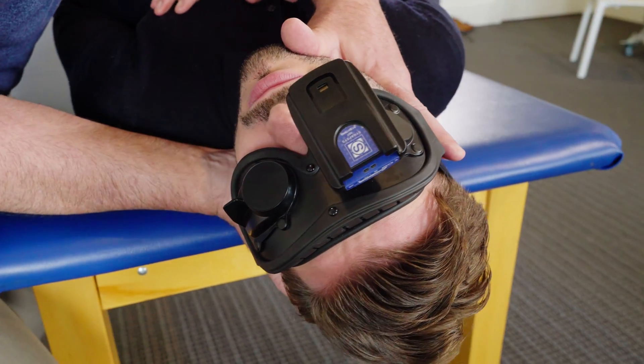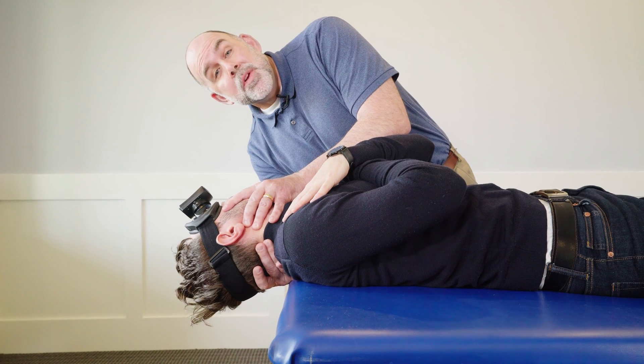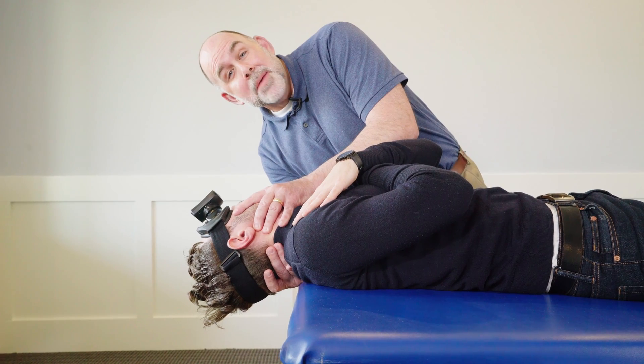The reason we hold for 30 seconds is because with BPPV, it's been shown that there's an onset latency of between 5 and 20 seconds. If you take the patient out of the position too soon, you may not capture the nystagmus.